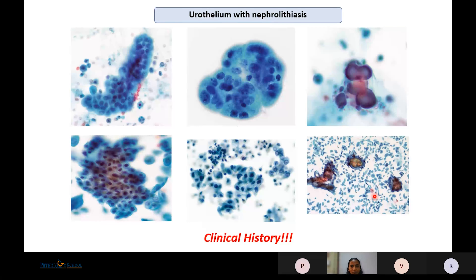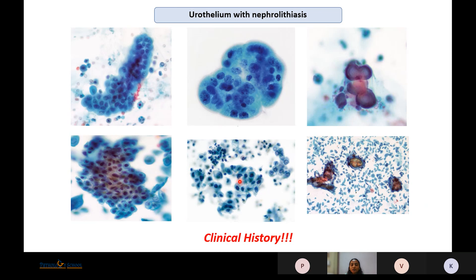In cases of nephrolithiasis, we can have tight clusters with nuclei showing hyperchromasia, nuclear overlapping, prominent nucleoli, and calcium concretions. The nuclei may appear hyperchromatic, but because we know the clinical history of nephrolithiasis, it is still placed in Negative for High-Grade Urothelial Carcinoma. If the history was not known, this could have been labeled as atypical urothelial cells, but with a known cause for the atypia, this degree of hyperchromasia is acceptable.